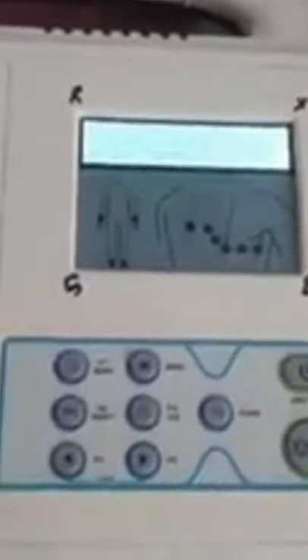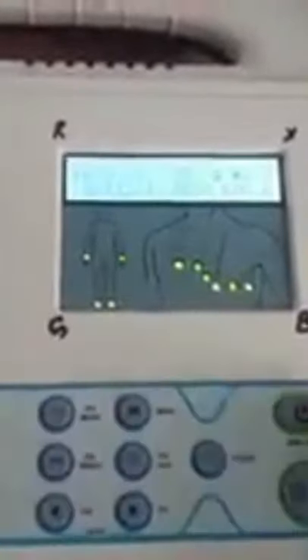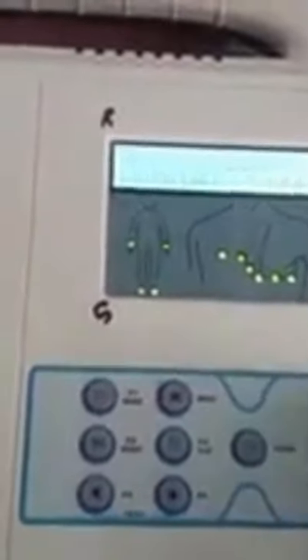This is basically a digital ECG machine. Here are the four leads. We remember them as: red for right arm, yellow for left arm, green for left leg, and black for right leg. We place these on the patient's wrist, press the button, and the machine will automatically read the heartbeat and print out the ECG. You can see here the printout.